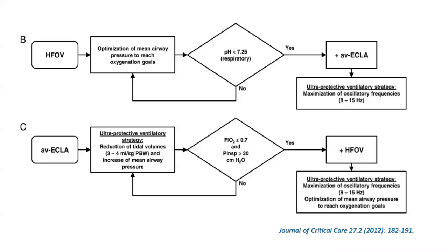So it is not like conventional ventilation, where if you play with the PIP pressure or rate to ventilate the patient, you might affect the oxygenation the opposite way. So oxygenation is independent from ventilation. It is easy to use, and it provides ultra protection for the lungs.